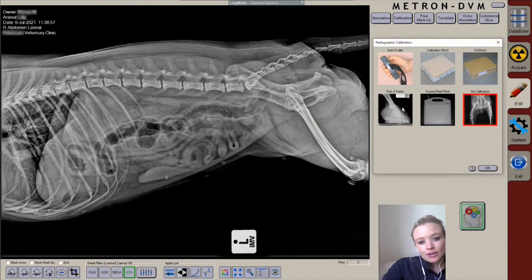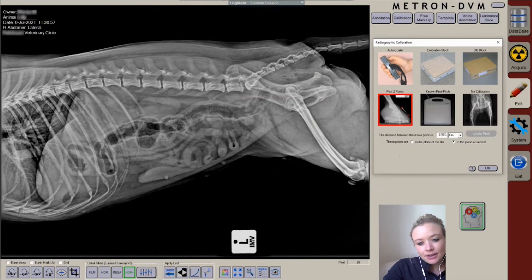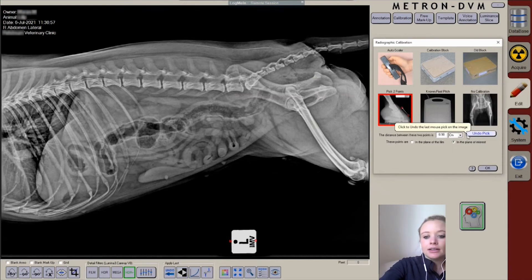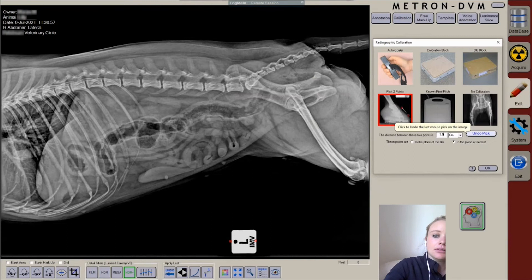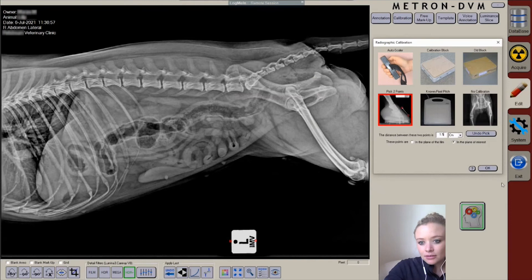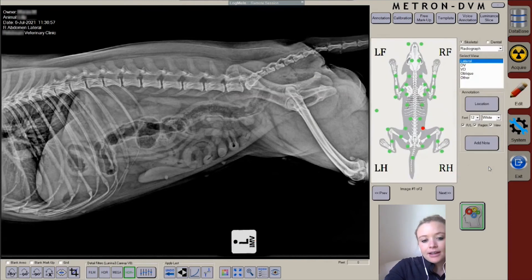So if I know that this marker is in fact one and a half centimeters in width, then I can just mark it and enter that value, and that will calibrate my image.